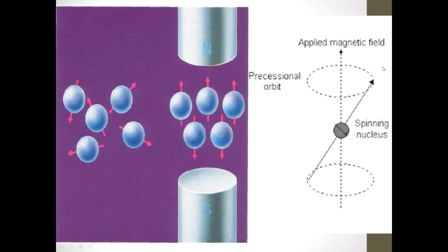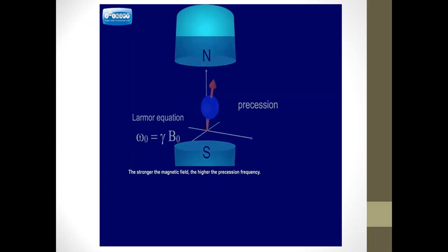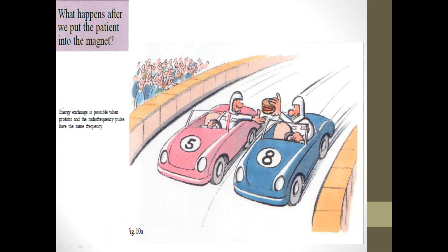So now it's important to know the precessional frequency. Why is it important to know the precessional frequency? Because if we know the precession frequency of protons, it's easy to excite them. As I told you before, if you have two cars or two drivers moving with the same speed, it's easy to transfer energy from one car moving with the same speed to another car.